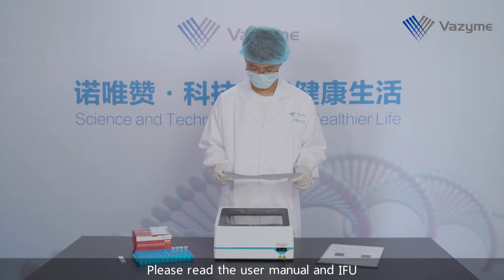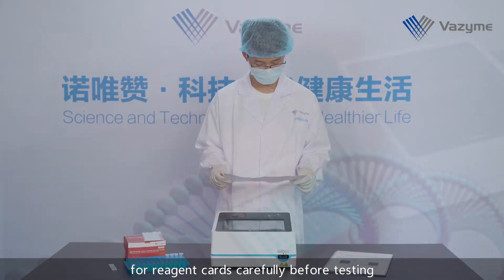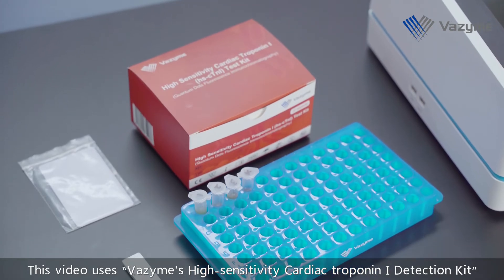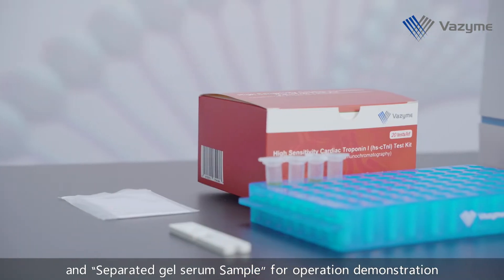Please read the user manual and IFU for reagent cards carefully before testing. This video uses Vazyme's High Sensitivity Cardiac Troponin I Detection Kit and separated gel serum sample for operation demonstration.